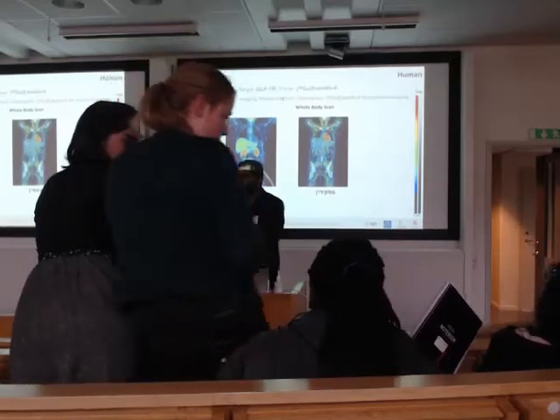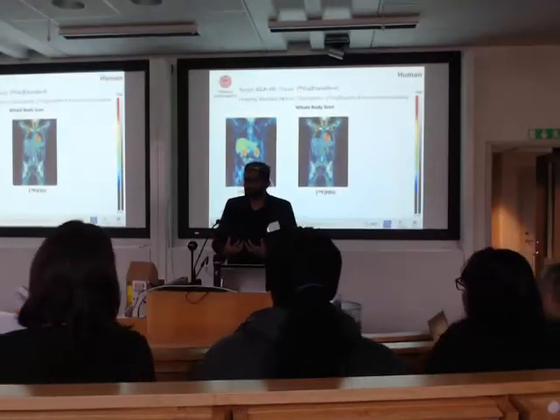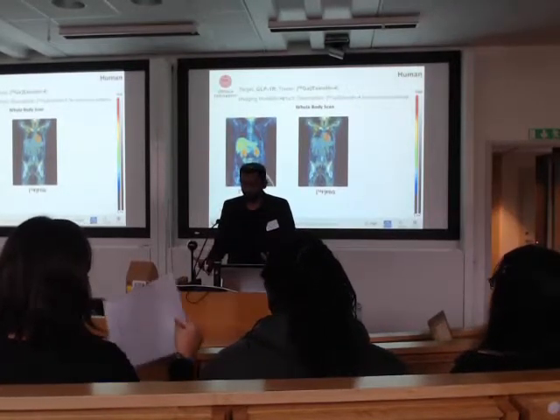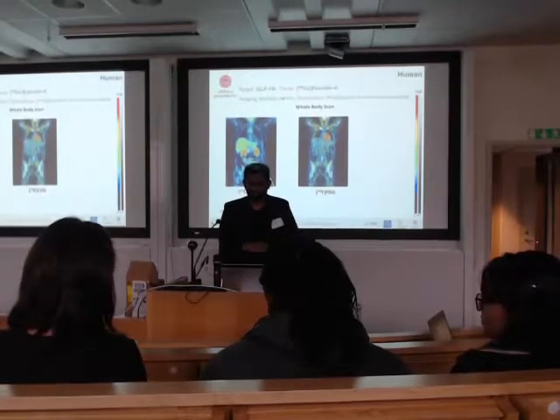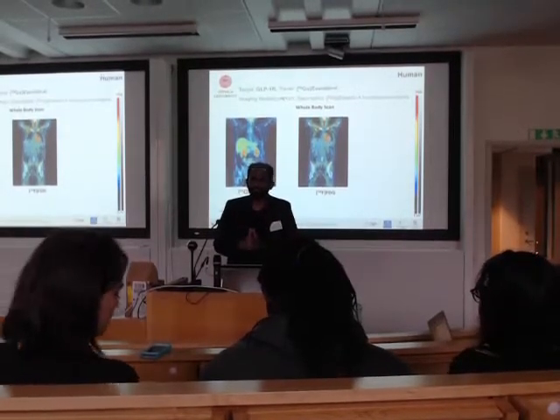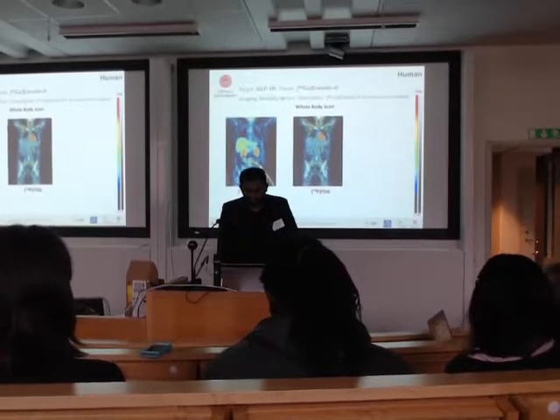I mean, basic story: FDG is nothing but glucose. Tumor cells accumulate it, as their metabolism is relatively faster compared to normal cells. That's the reason they take up a lot of glucose. If you radiolabel this glucose, that's what you see as an output in the FDG scan. All right, 5-HTP failed, FDG failed. Until now, we had all this data from the monkeys, pigs, rats, and other stuff. So we asked the authorities if we can do this compassionate case study. The physicians took responsibility. Then we did the scan.